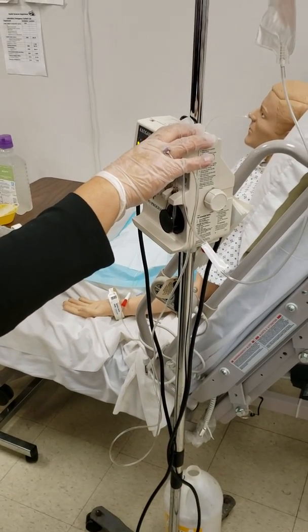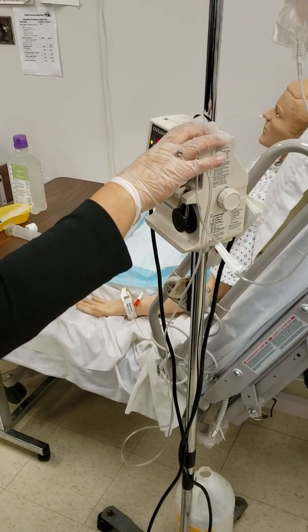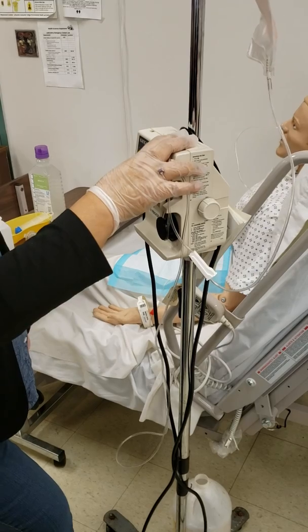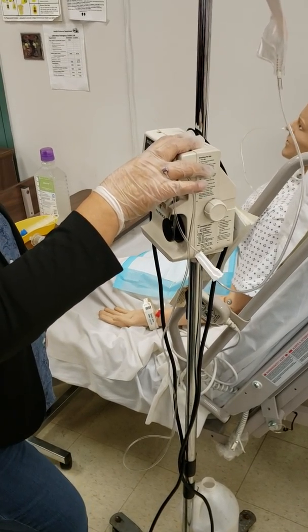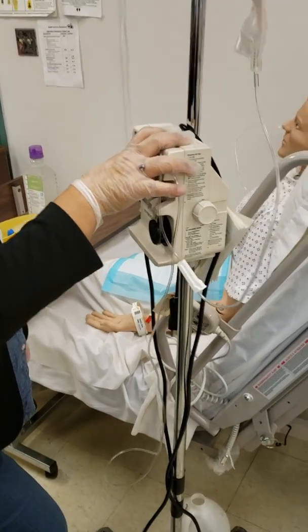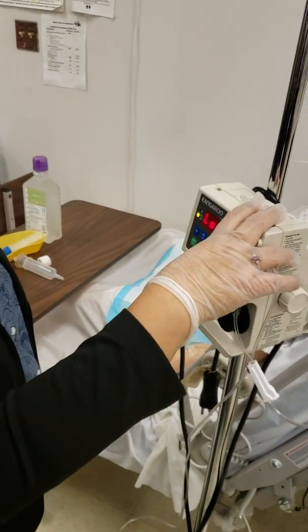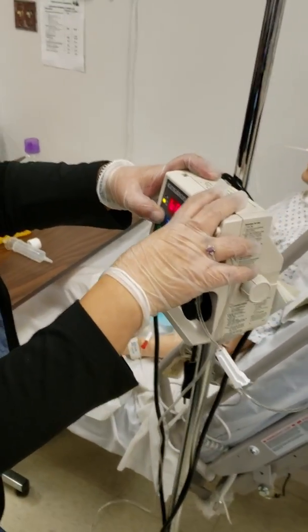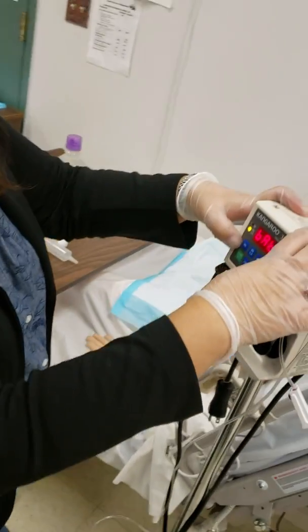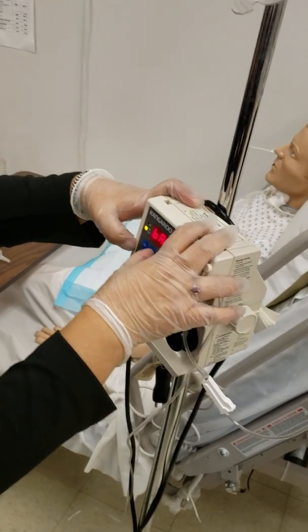Hopefully it has enough batteries. Oh, low bat. Right. So the first is you're gonna put how much? Let's close it. This is the volume. Can you see?